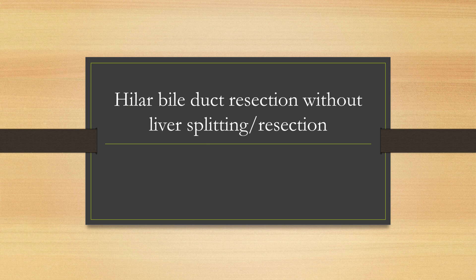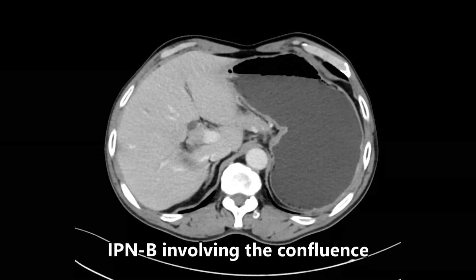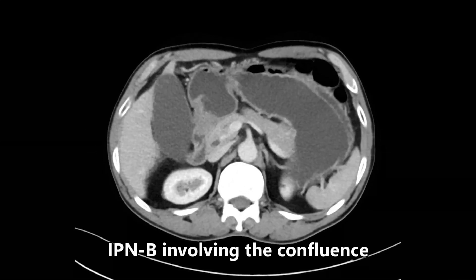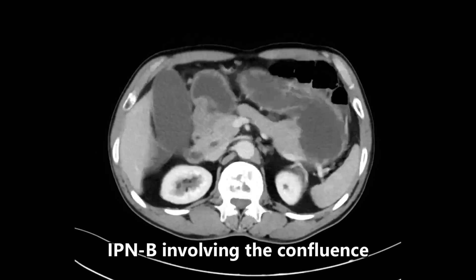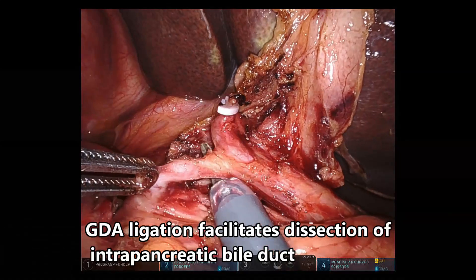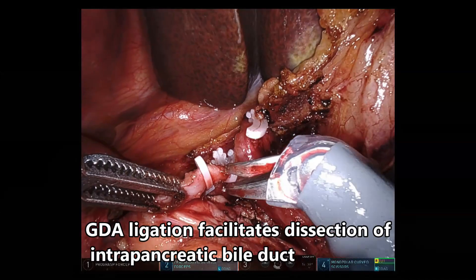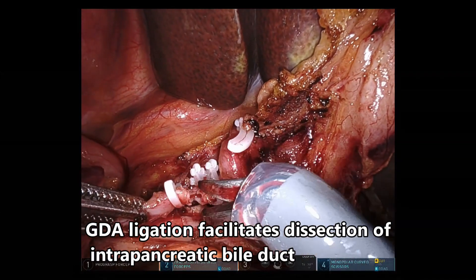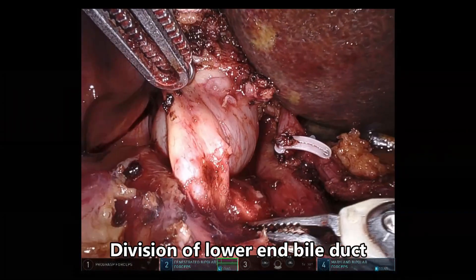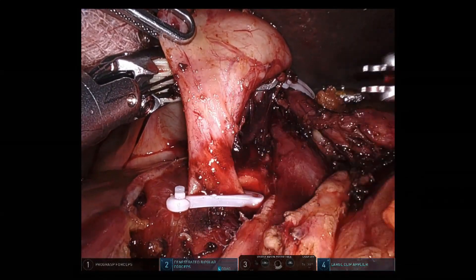We will initially describe hilar bile duct resection without liver splitting or resection. This is a CT image of a patient with intraductal papillary neoplasm involving the primary hepatic confluence without extension into the sectoral bile ducts. In this group of patients, the division of the gastroduodenal artery facilitates dissection of the intra-pancreatic bile duct, thereby facilitating a negative resection margin. The intra-pancreatic portion of the bile duct is dissected, clipped with Hemlock clips, and divided.